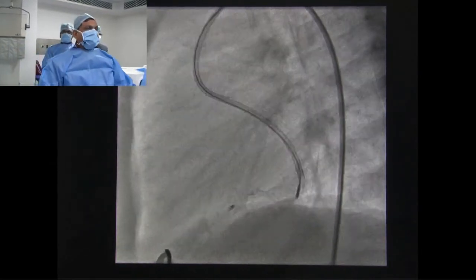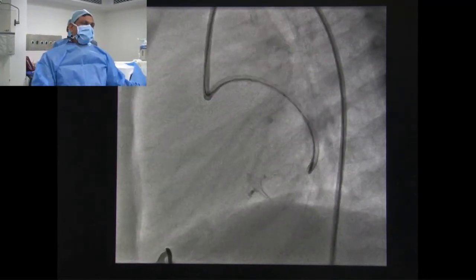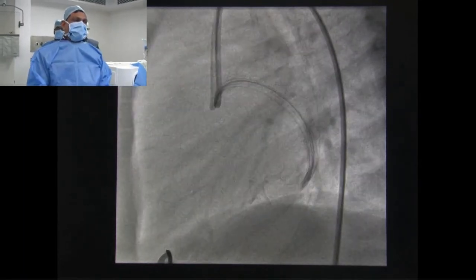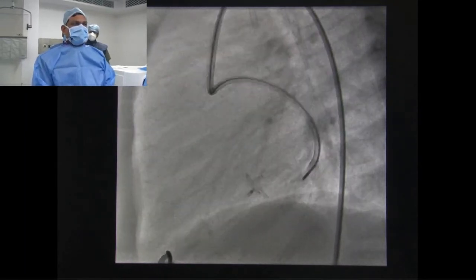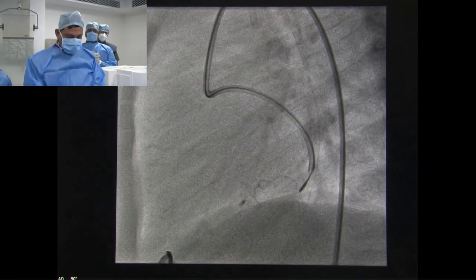Because if you see, the very fact that you used a coronary balloon to occlude it, a 4 mm balloon, the narrowest part cannot be more than 4 or 4.5 millimeter. You could upsize to 6 or 6.5. So we'll give one angio now after 5 minutes. Can you please give one more angio?